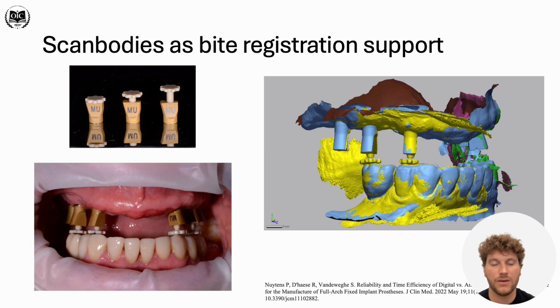But if we consider going from nothing to fixed implant temporary restorations, then this is a really convenient and fast way to fix the vertical dimension, and then we can adjust those few hundred microns in the mouth with the patient and let the patient leave with nice fitting, occlusally and aesthetically good looking teeth.